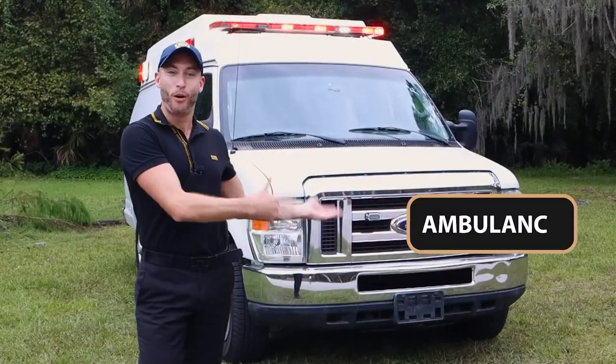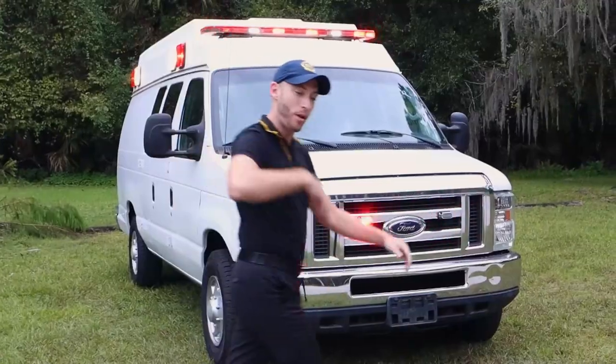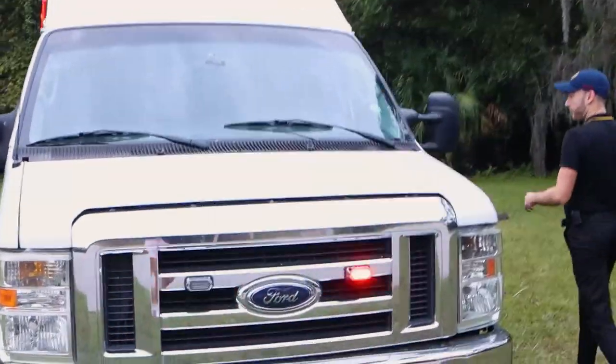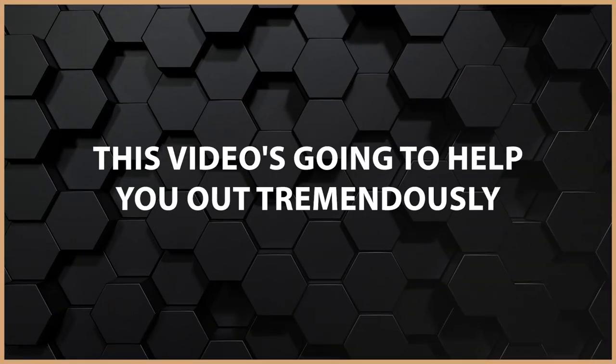As you can see, I have just bought an ambulance. I'm going to walk you through it right now, step by step. So if you've never seen inside an ambulance before, especially if you're new to EMS, this video is going to help you out tremendously. I've bought this ambulance for training to help you.